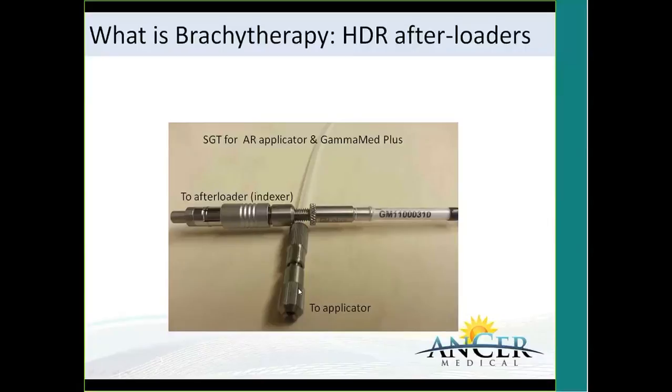Most of the errors in brachytherapy are due to incorrect geometry. And for Gamma Med, that length from the face of the machine to the end of the applicator is fixed, and the machine itself will check for this. But not all afterloaders do that. So if you go to a facility that has a Nucletron unit, they will go through extra steps of QA, of measuring each catheter, entering that measurement in the treatment planning system, and then double-checking it to make sure that everything is programmed correctly.